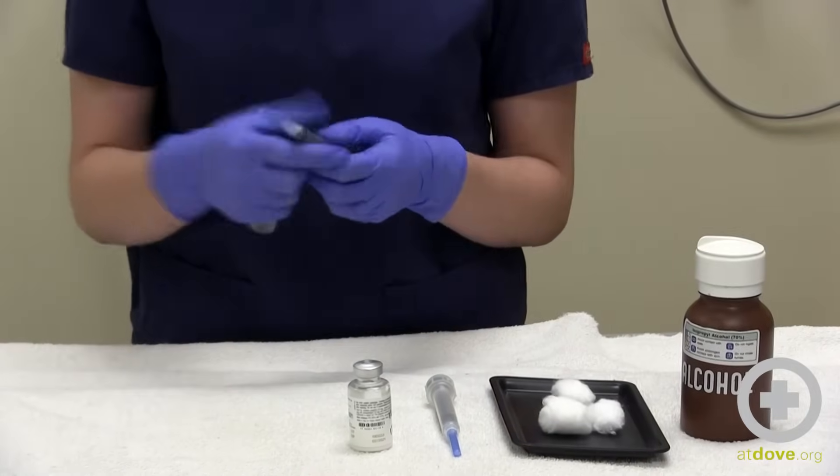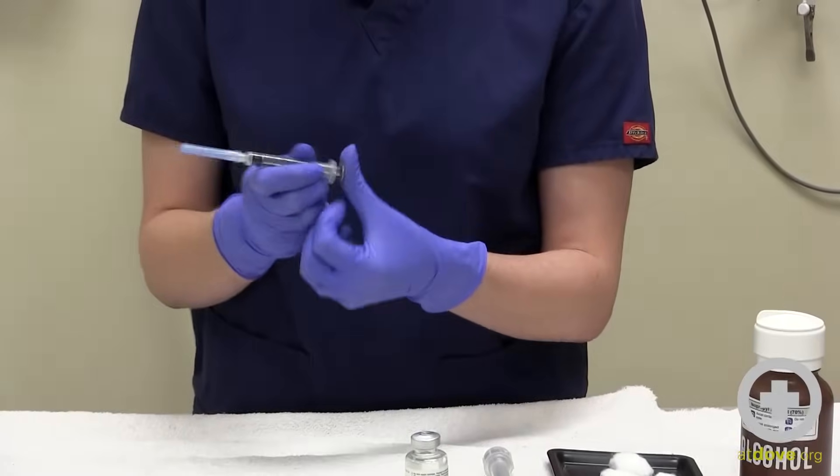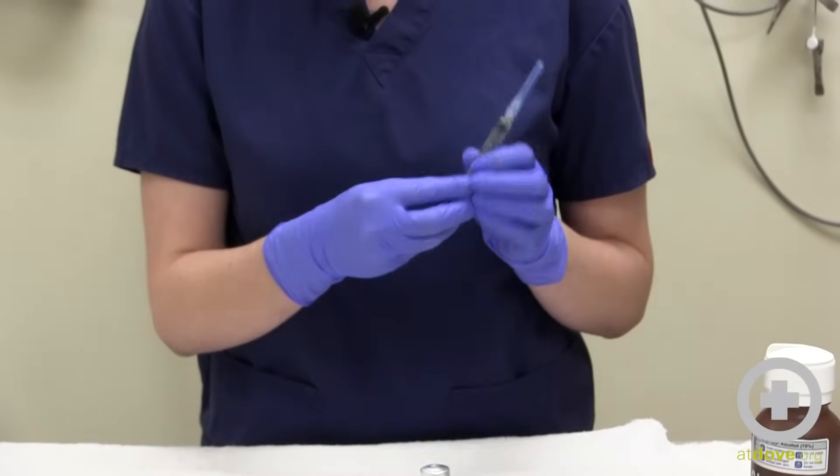Open your new syringe. I like to depress the syringe so that you can break that seal and it's a little bit easier to draw up. Make note of where you're going to be drawing to.